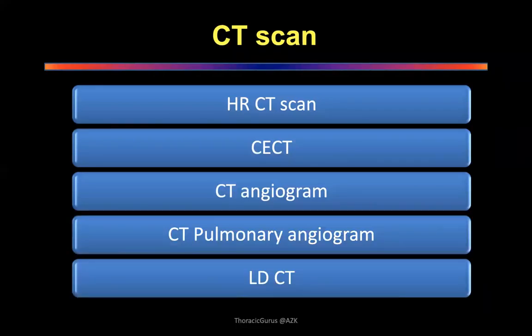And then you have the low dose CT. A low dose CT is used as a screening tool where the dose of the CT is dropped dramatically. You're not really looking at the mediastinum in great depth. You're looking at the lung tissue, trying to find out if there are subtle changes or early signs of lung cancer. So purely by manipulating the Hounsfield units between plus 3000 and minus 1000, and by changing the timing of the capture within the same device, you can actually get all these CTs done, okay?